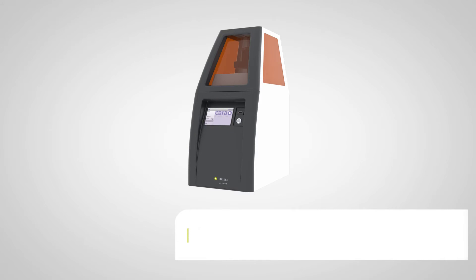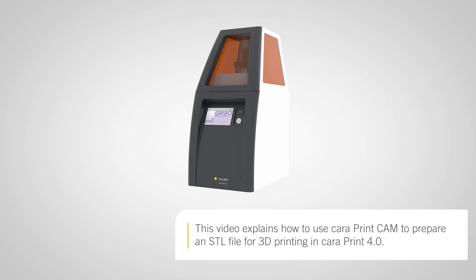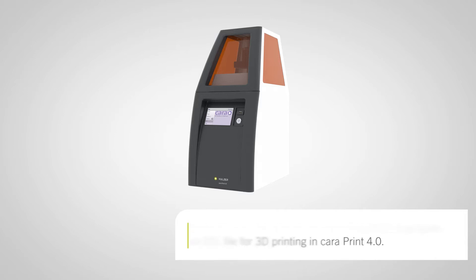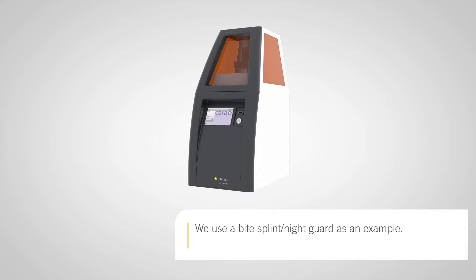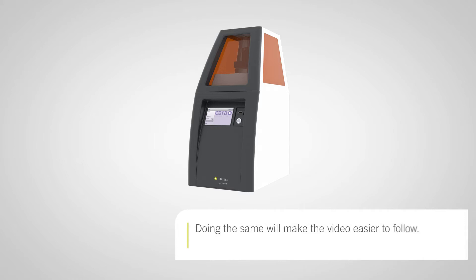In this video, we explain how to use CaraPrint Cam to prepare an STL file for 3D printing in CaraPrint 4.0. We will use a bite splint, also called a night guard, as our example for the video. It will be easier to follow the video if you do the same.